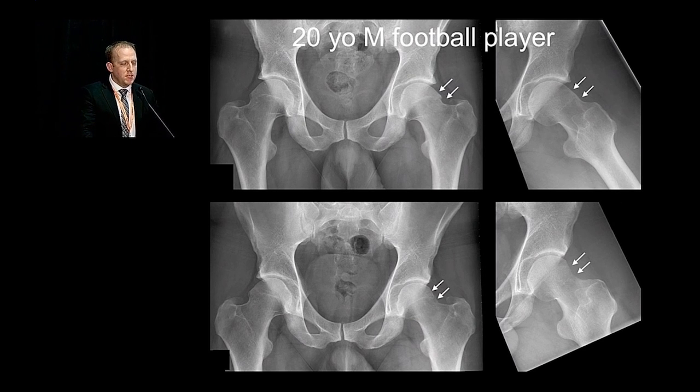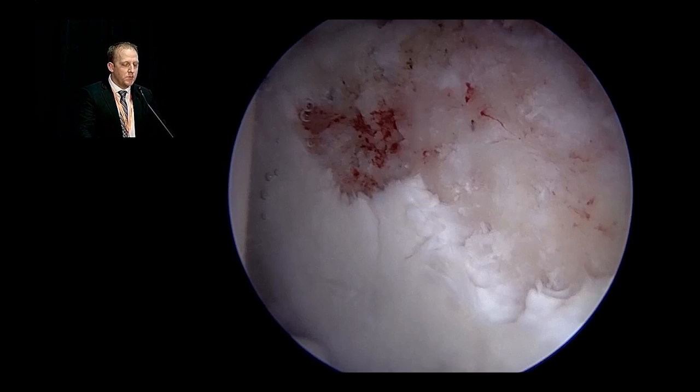Before we start with a case, this is a 20-year-old football collegiate player of mine who underwent a hip arthroscopy and labral repair. You can see when you compare the preoperative images above to the postoperative images below, you would expect with a very good correction that this patient should have pretty good outcomes. But intraoperatively, his acetabular side of the joint looked like this.